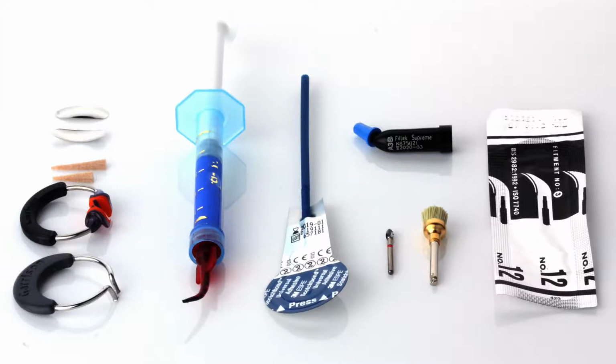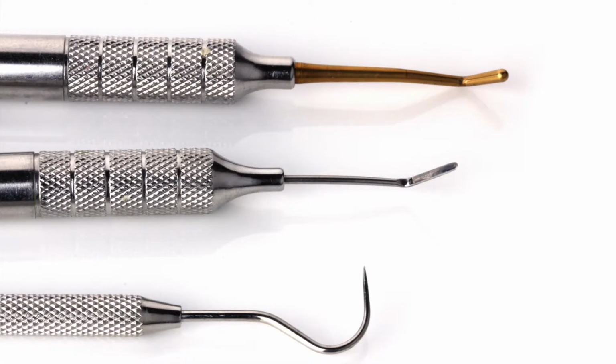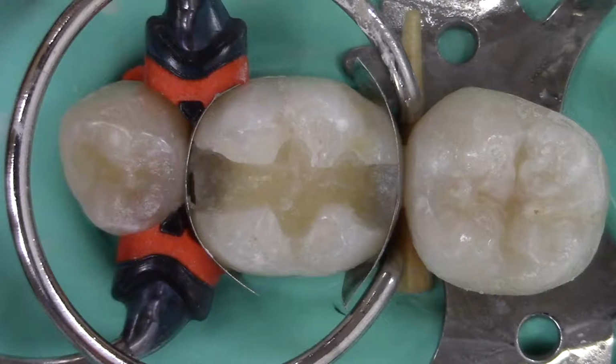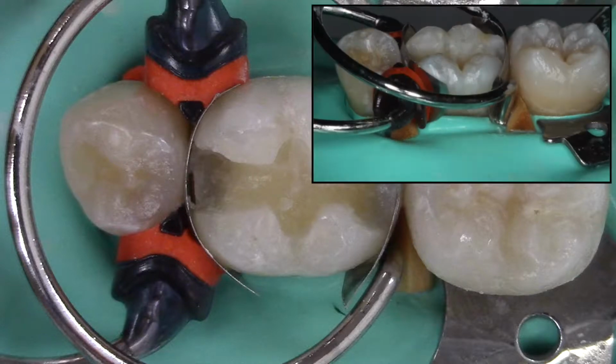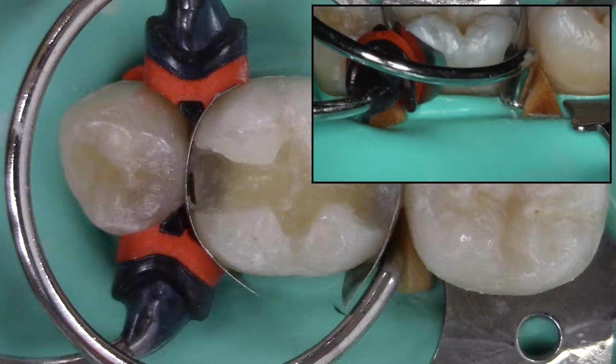The armamentarium for this procedure is Ultra-Etch phosphoric acid etchant, Scotchbond Universal bonding agent, Filtek Supreme body composite resin, composite placement instrument, interproximal carver, explorer, and light curing unit. This molar has been prepared with an MOD Class II preparation. The teeth are properly isolated with a rubber dam. Sectional matrices, wooden wedges, and rings have been placed and burnished.